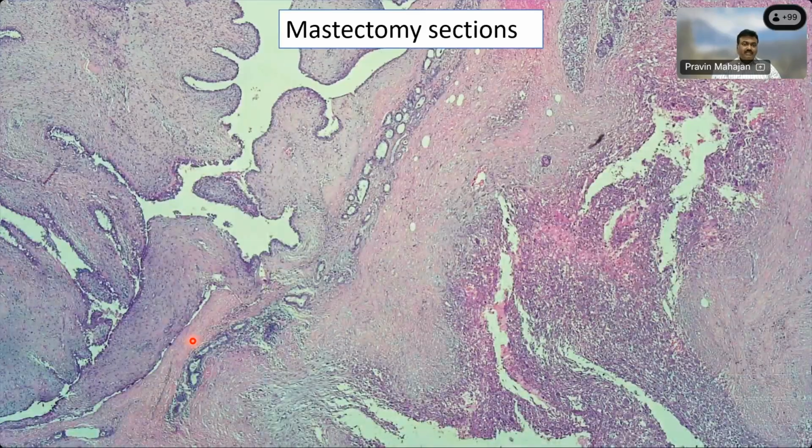To my surprise, the mastectomy had this fibroblastic tumor along with this tumor which I described, which was seen in the core biopsy, very malignant tumor, sarcomatoid or pleomorphic, and then you had this phyllodes, which has got, how do you say it is phylloid? Because it has got very exaggerated intracanalicular pattern or leaf-like pattern, very heterogeneous morphology, subepithelial stromal condensation. And then you have this tumor, along with that there is this malignant tumor also. So this was not a carcinoma actually. This was phyllodes only, which has got this very dedifferentiation or high grade phyllodes, which can show you all this.